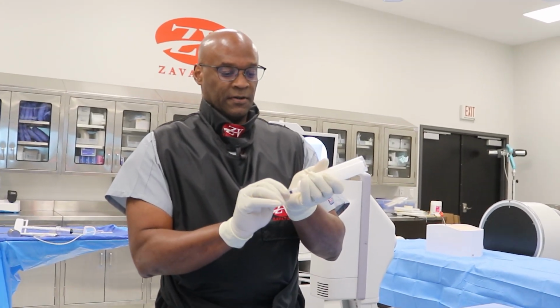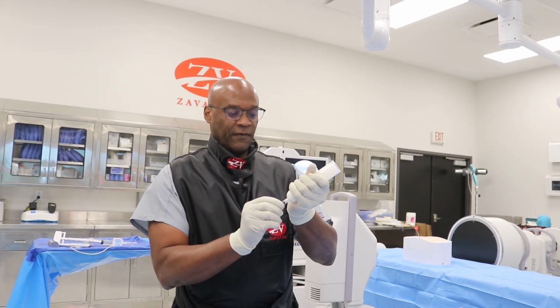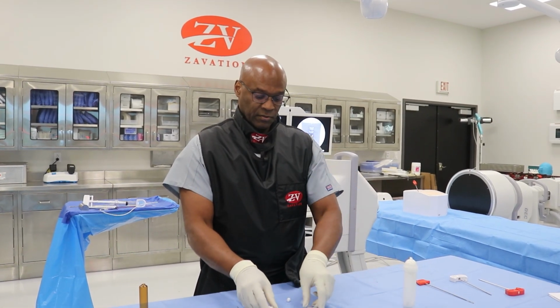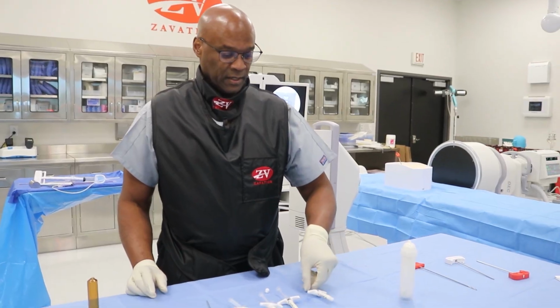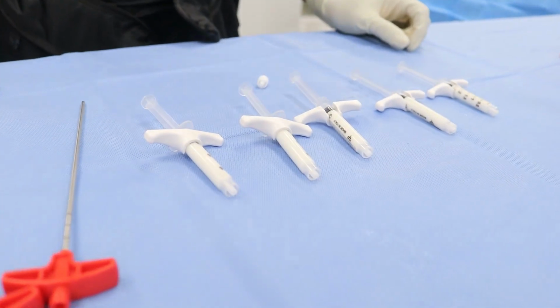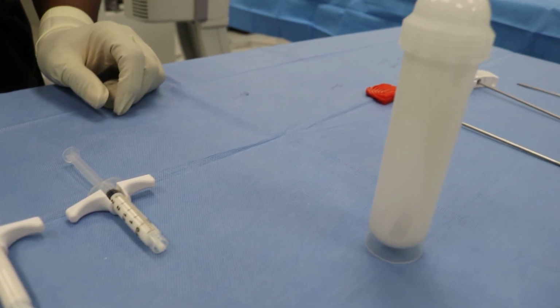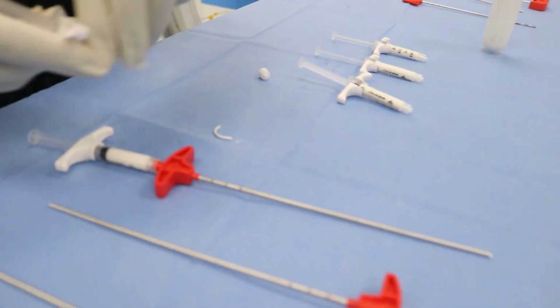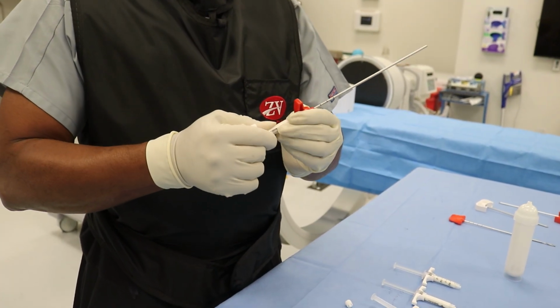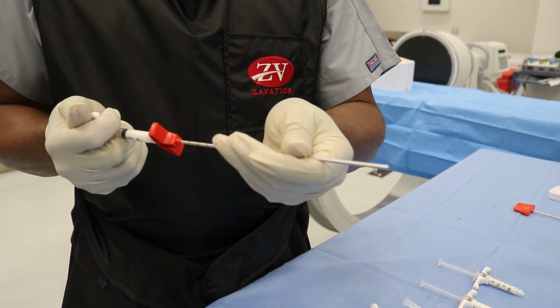Now we're filling the transfer syringes with the cement. Each syringe has 2.5 cc's of volume. Once we have the syringes filled, we'll need to wait 3 to 4 minutes for the viscosity to set, and then we can commence with infusing the cement into the vertebral bodies. Now I'm beginning the process of filling the bone fillers. Each bone filler holds 0.9 cc's of cement.